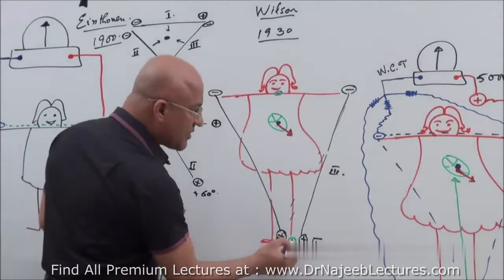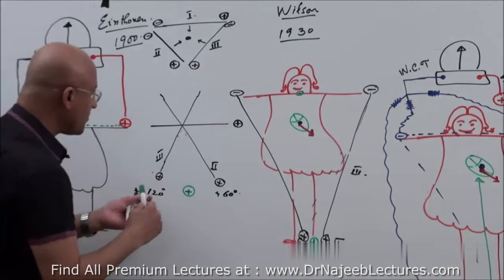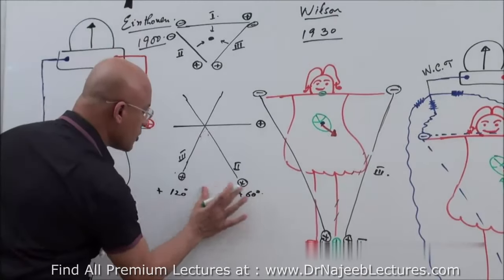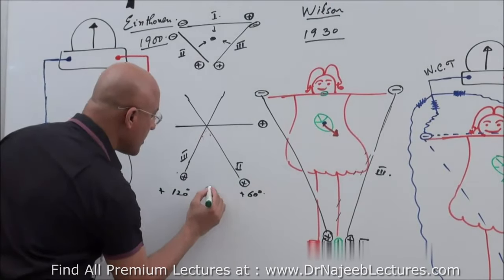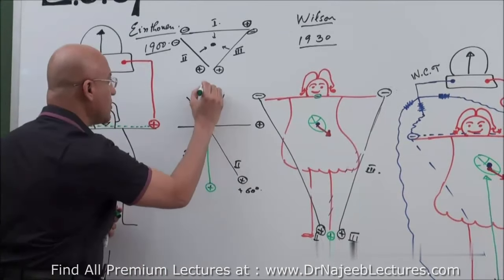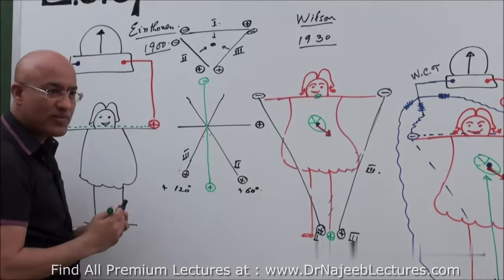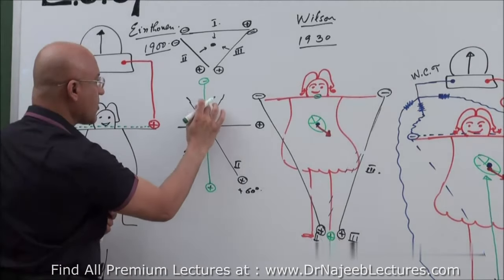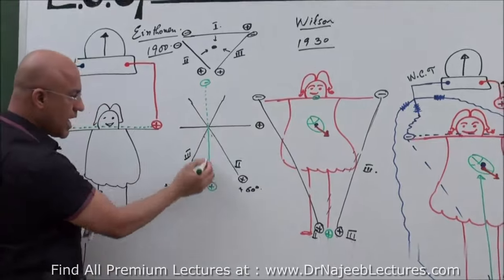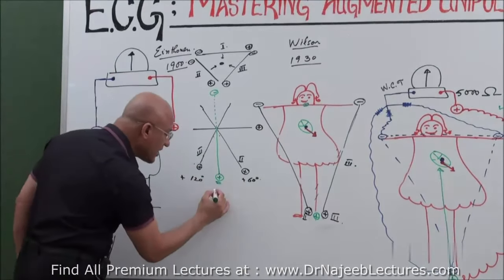When you put negative here and positive here, the axis will go straight up. So this will be a view. This view is passing like that. Right? Am I clear? Now this is a voltage.